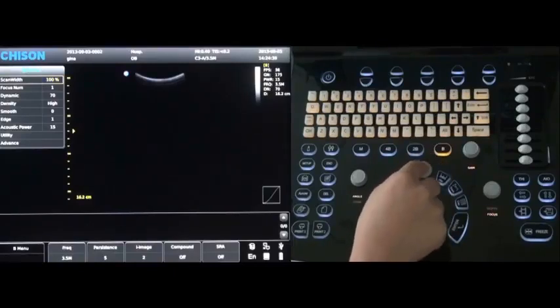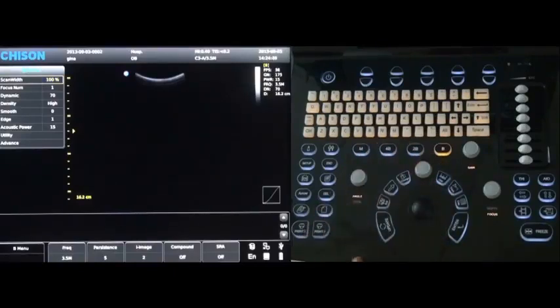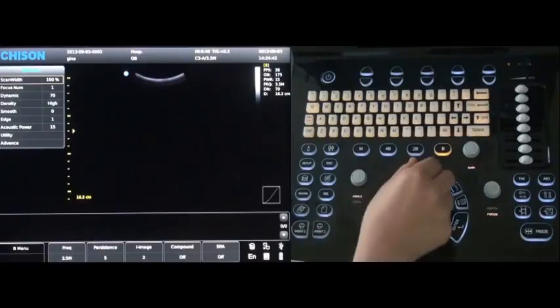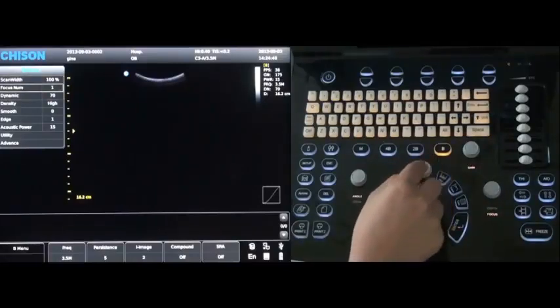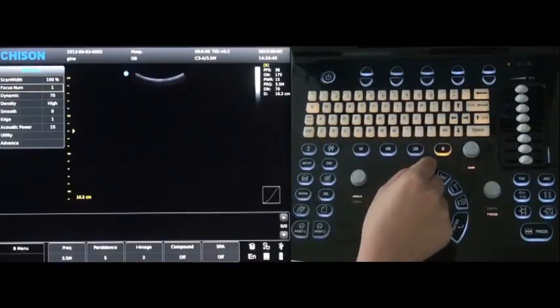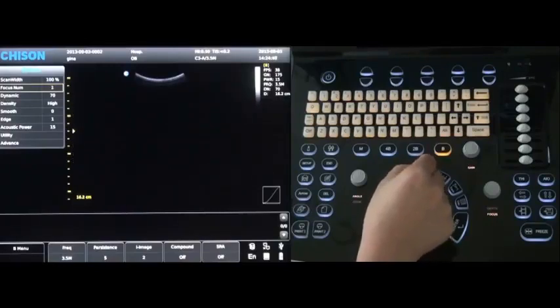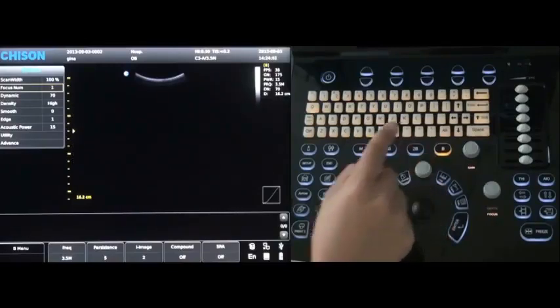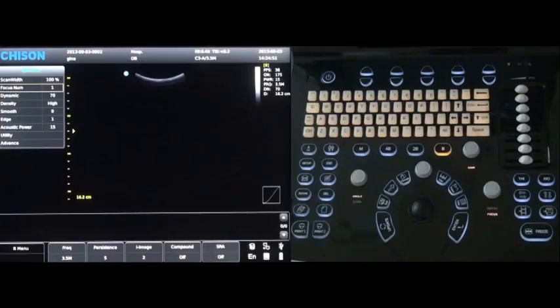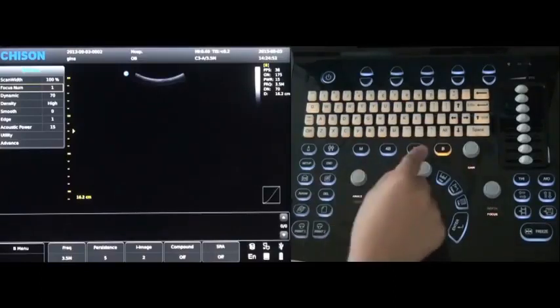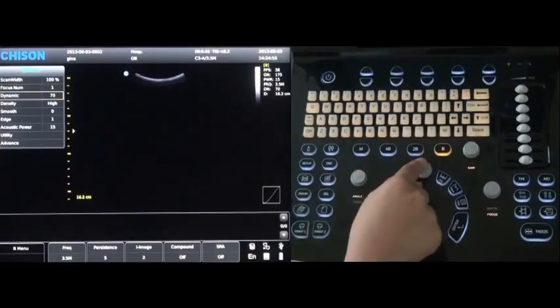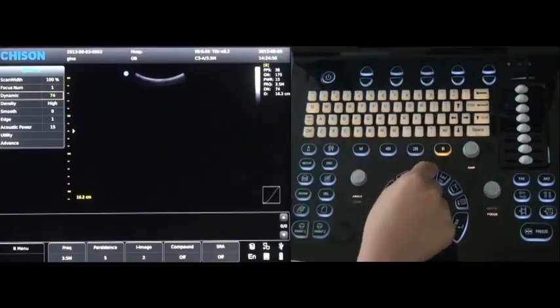Press the key to change the bandwidth, up or down. Then rotate it, press again to change dynamic up or down.